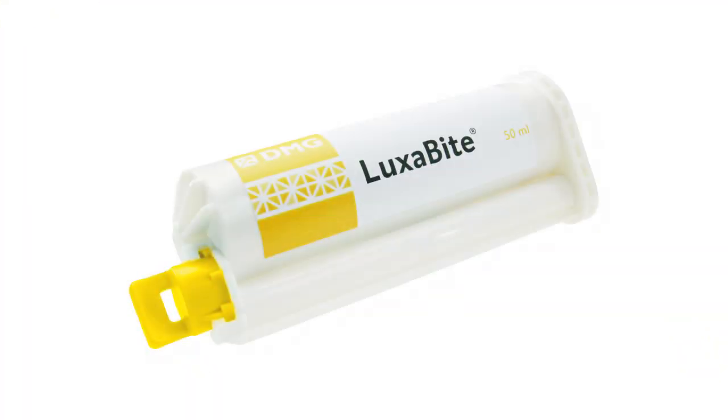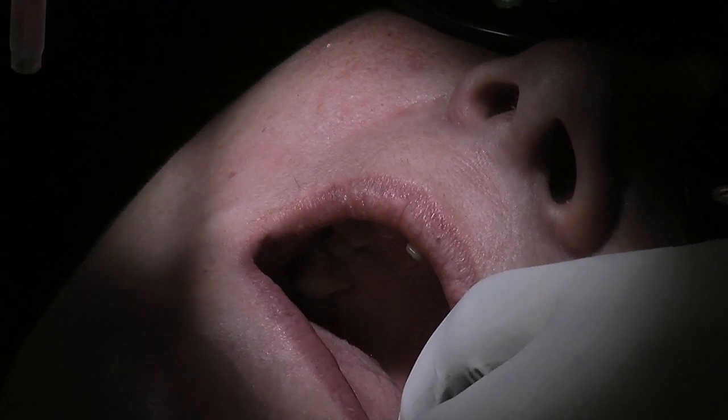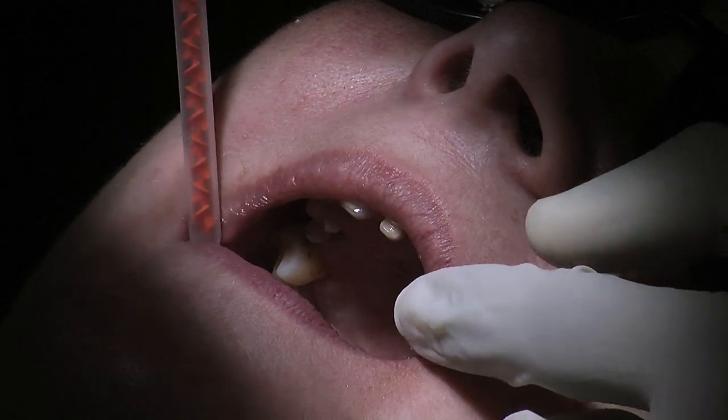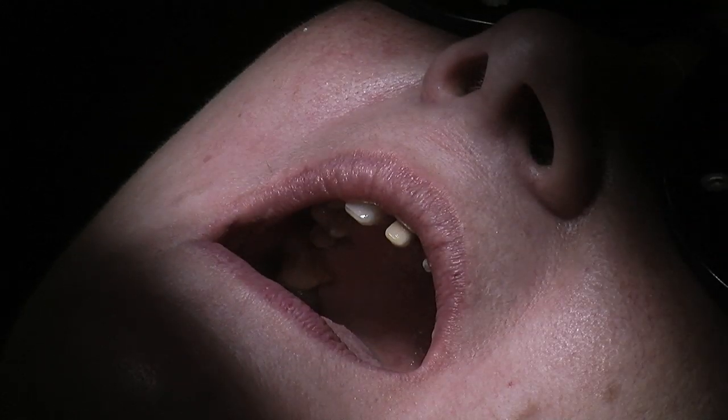The other bite registration material which I very commonly use, which is actually very, very accurate, is something called Luxabite. So in this particular case, I'm going to just do a tripod effect — a small amount on the molar at the back, small amount at the front, and small amount on the molar on the right side. And literally ask the patient to bite together firmly and hold it in place. This normally takes about two and a half minutes to set, so I do like to time it accurately.